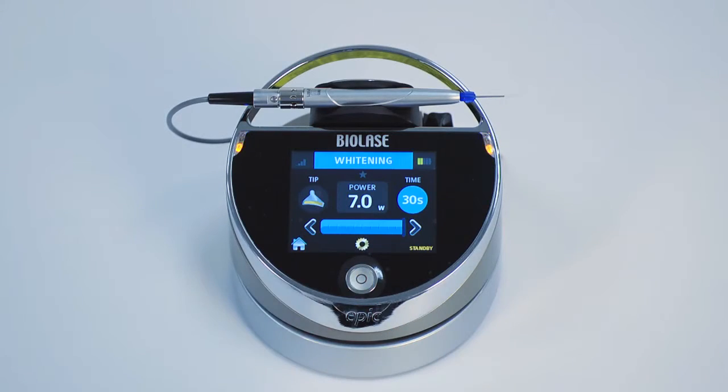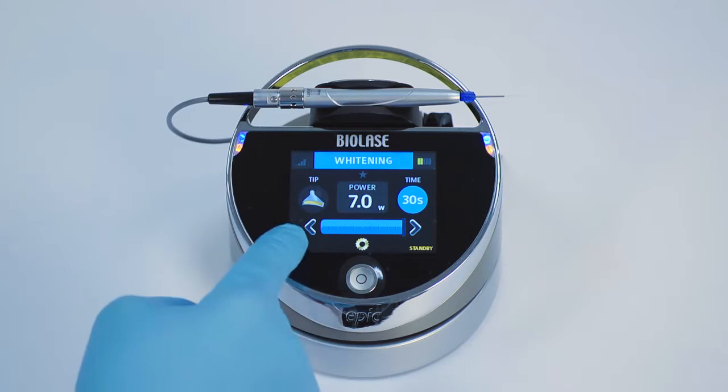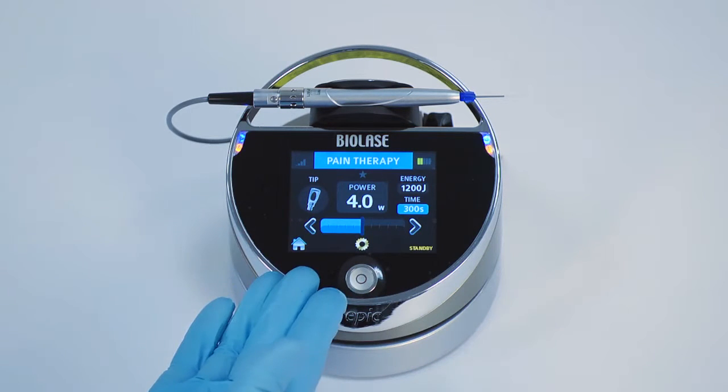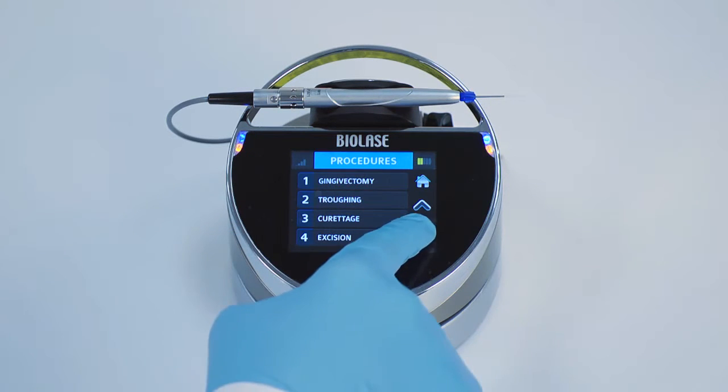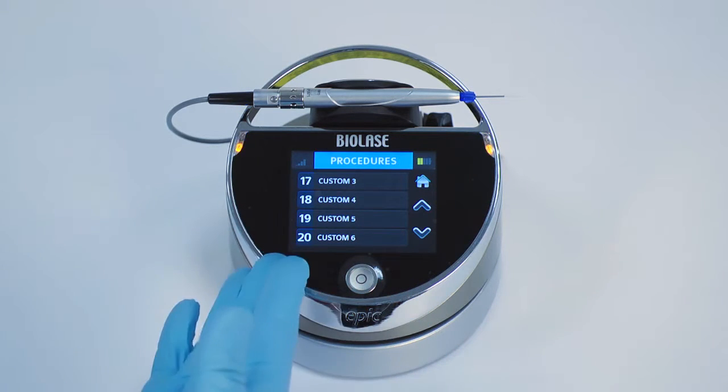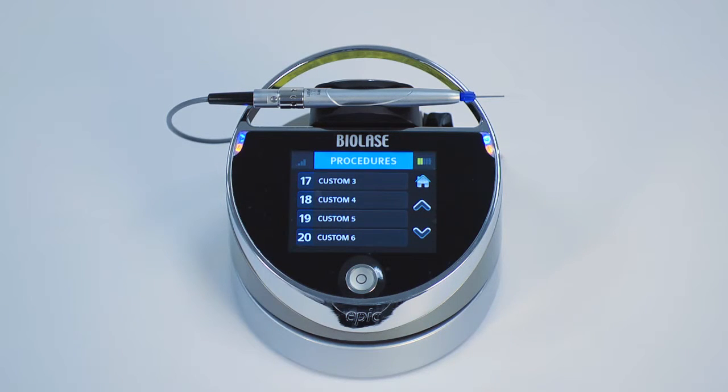When you press whitening or pain therapy modes, you will enter a single screen with adjustable settings. When you press soft tissue mode, you will enter a procedure screen. From this scrollable list of procedures, you can select 14 preset procedure settings or 6 custom procedure settings.